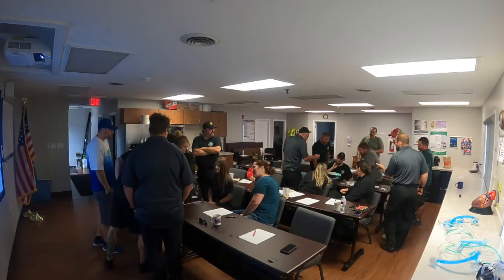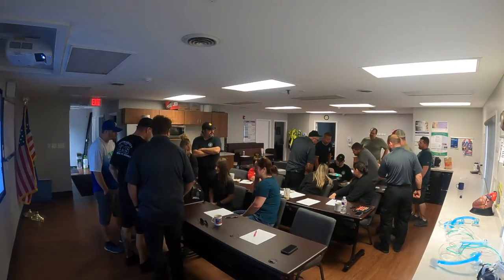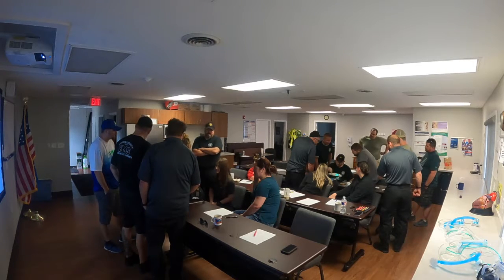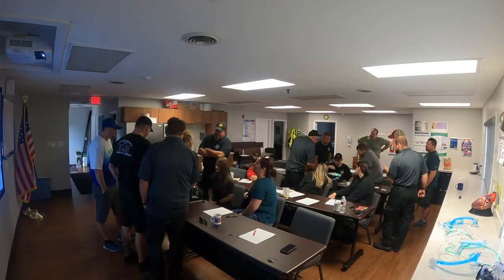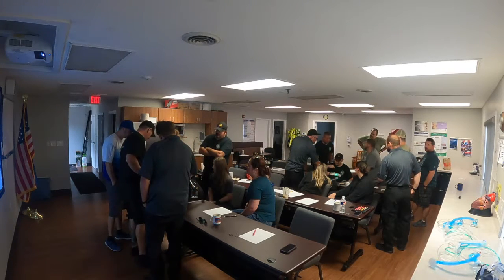Okay. So what mode do you guys have set now? We got AC pressure support. But I think we need breaths per minute. But you just forced it on there? No, need 23 breaths. It's supposed to be on.